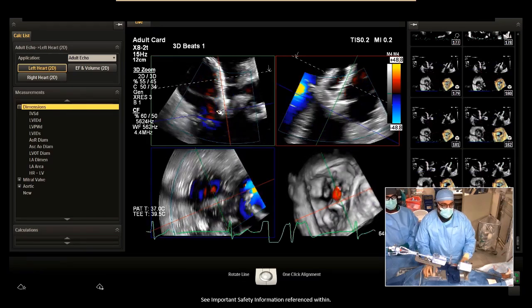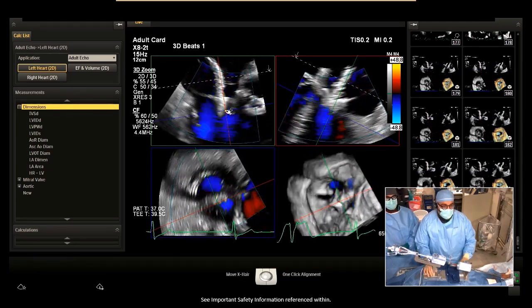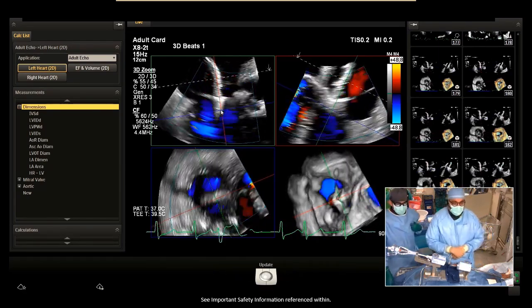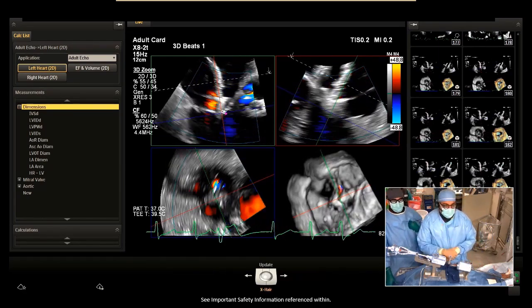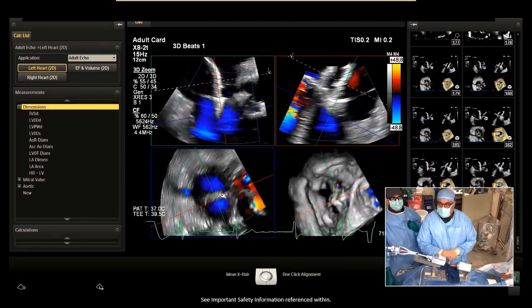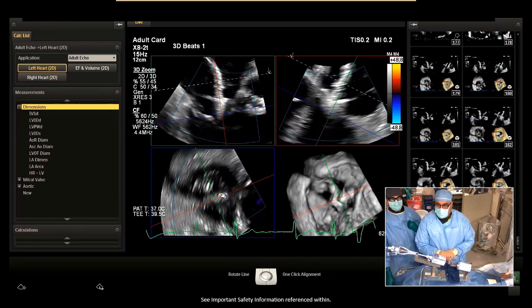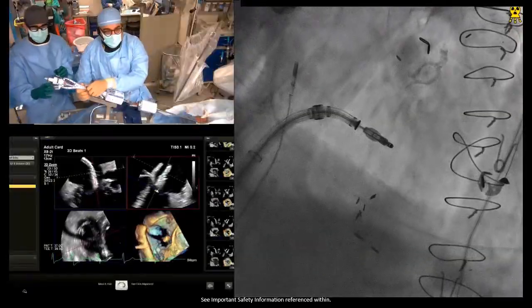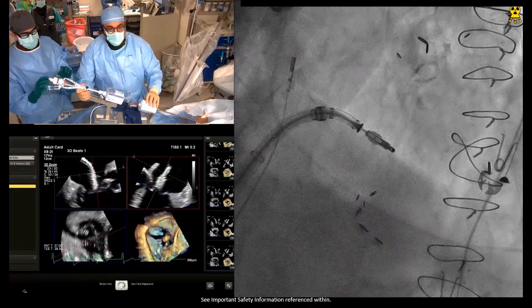I can try to scooch this thing a little bit more central, because we're not going to grab the gap itself, right? But we're just going to grab kind of mid to central. How does that look right there? Yeah, that's more central there. That's where you're sitting, and I think that's a great location. You're at the aortic edge of the TR jet. Okay, Edris, that looks good to you? Yeah. Okay, I think this is absolutely fantastic.